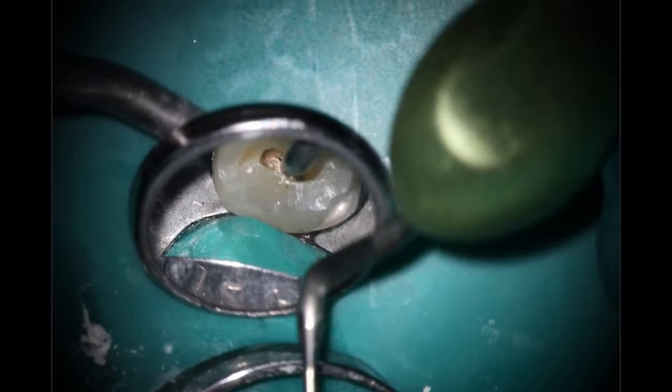Going back in with that plugger — the NiTi is beautiful to create that apical pressure we need for this technique and to go around any potential bends. This is a pretty straight tooth, but for curved ones you can rely on NiTi more than stainless steel. I'm trying to decide whether to use one post or two. I like to place posts inside these teeth to help prevent snap-off failure. The consideration for one versus two is really what the emergence out of the canal is going to look like. The buccal canal was nice and straight in the long axis with the tooth — that's where you need it to be. The palatal is coming out at almost the buccal cusp tip at that angle, so I'm just going to do a single post.